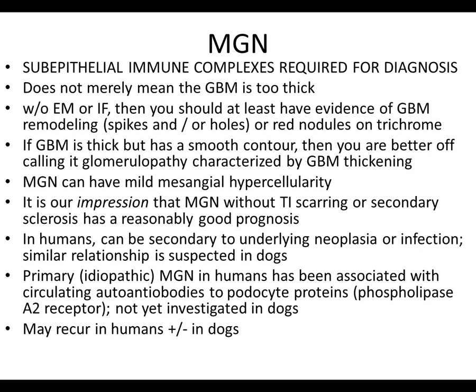If I'm unsure and I have just light microscopy, I simply call it a glomerulopathy characterized by glomerular basement membrane thickening. I don't go through with membranous because to me that is an immune complex mediated disease.